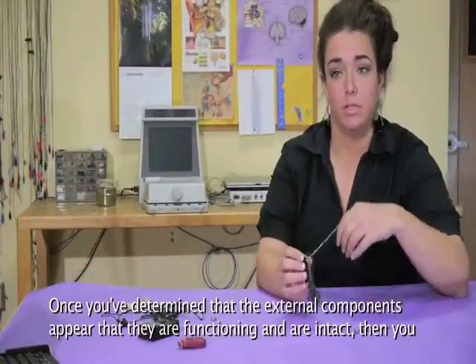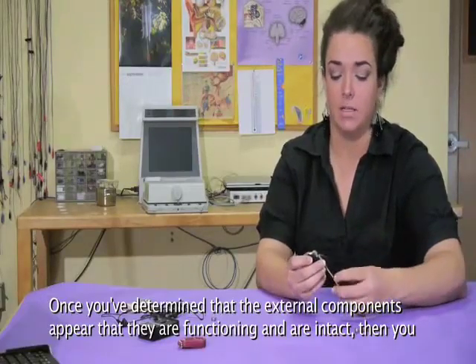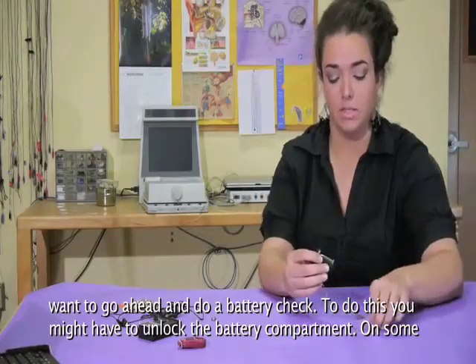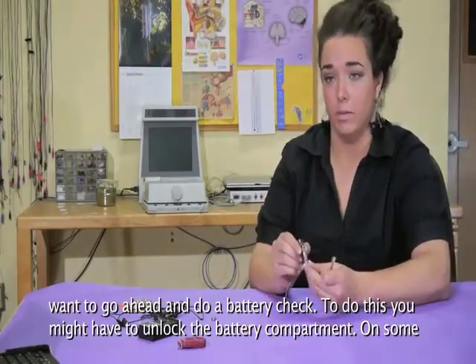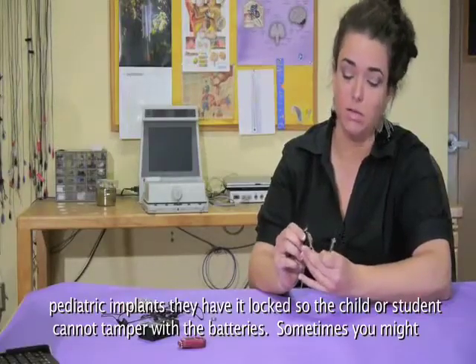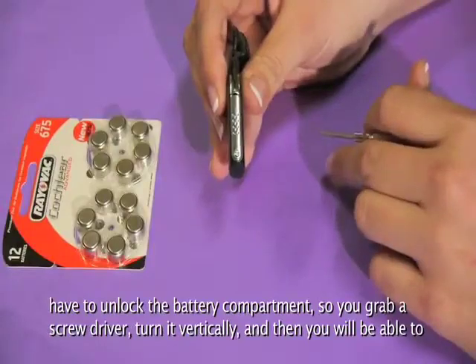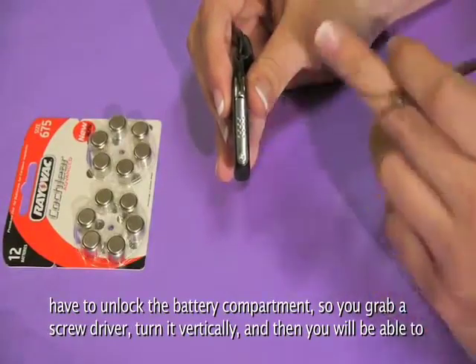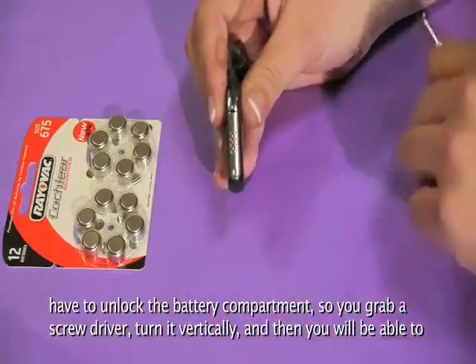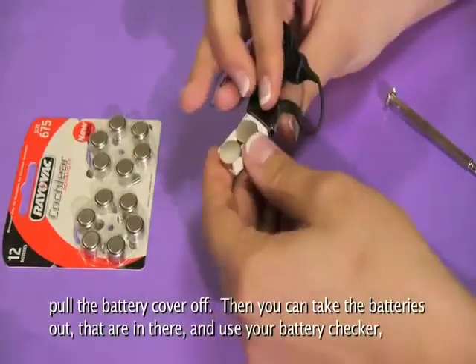Once you've determined that the external components appear to be functioning and intact, you want to go ahead and do a battery check. To do this, you might have to unlock the battery compartment. On some pediatric implants, they have it locked so that the child or student cannot tamper with the batteries. You would grab a screwdriver, turn it vertically, and then you'll be able to pull the battery cover off.